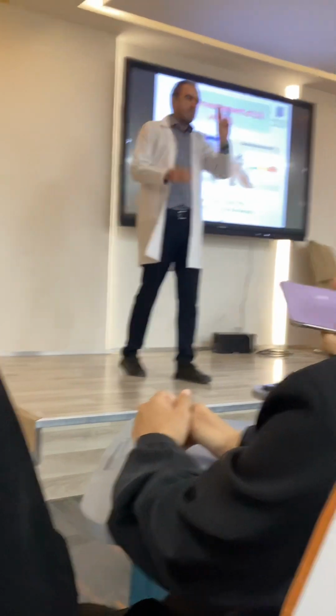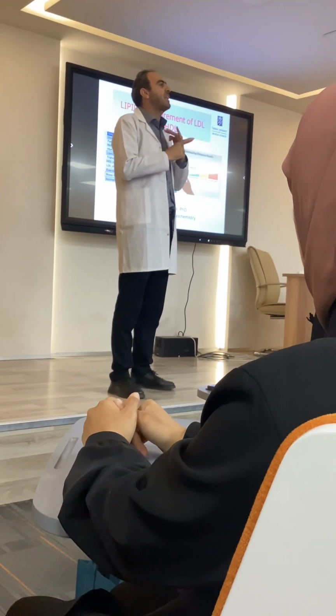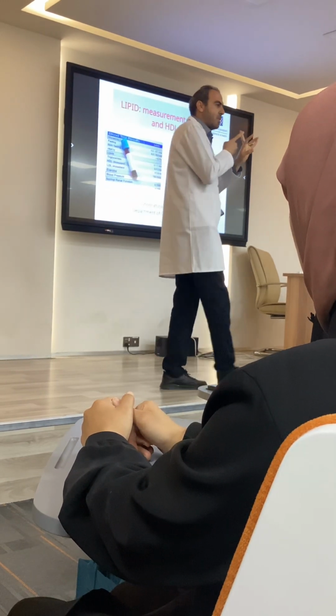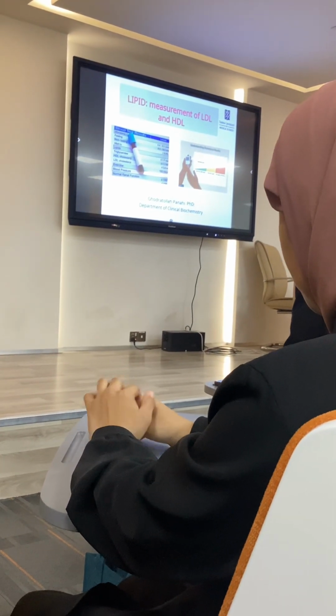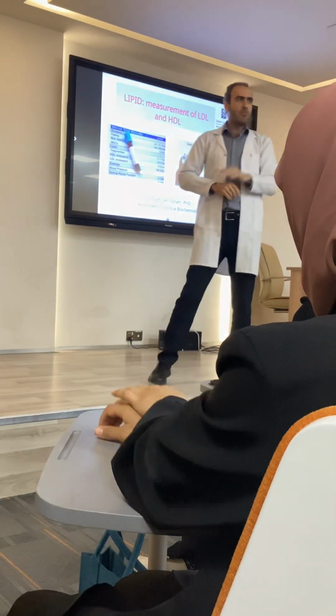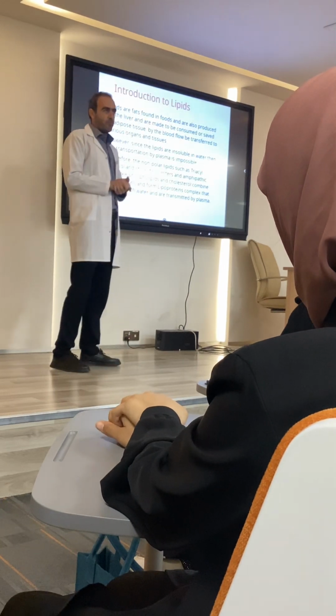So today we have four tests. Three of them you will do, and the fourth one you will calculate. Finally, you should report 5 numbers. What are they? The concentration of triglyceride, concentration of total cholesterol, concentration of HDL cholesterol, LDL cholesterol, and the ratio of LDL to HDL. So I need these 5 numbers, and they are known as a lipid profile.